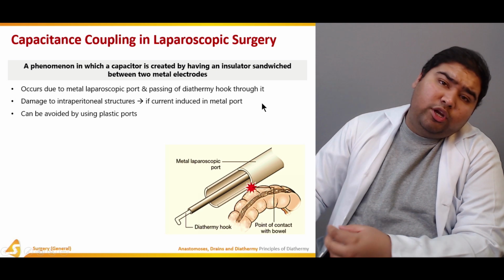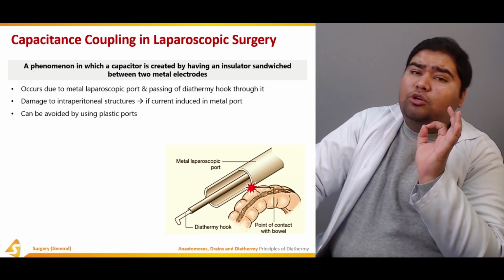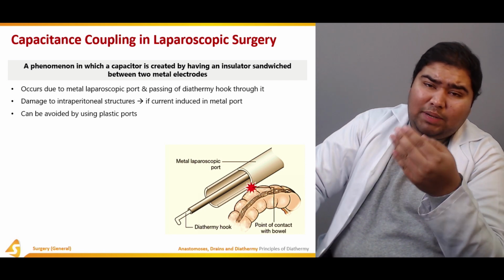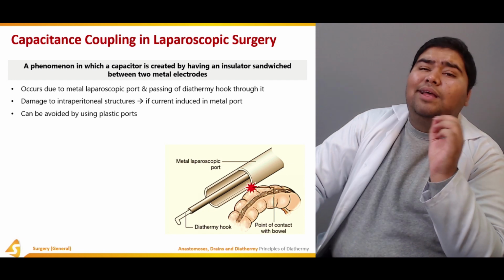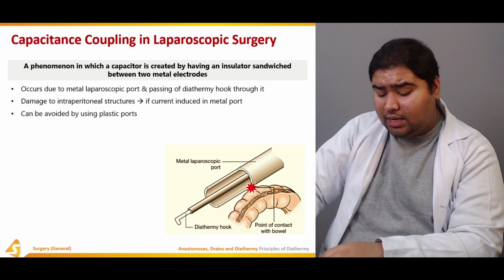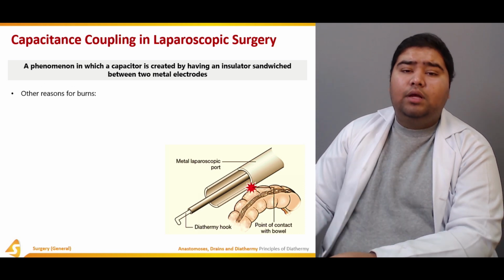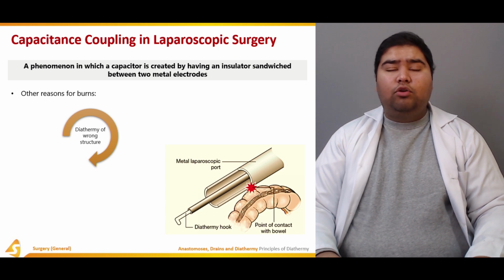Now this can be avoided by using plastic ports. So a very simple, easy procedure: you should use the plastic ports, and these plastic ports cannot be induced and they cannot be turned into capacitors, and since they're plastic, there's no conduction of electricity through them, so they're comparatively safe. Now other reasons for burns include diathermy of the wrong structure.